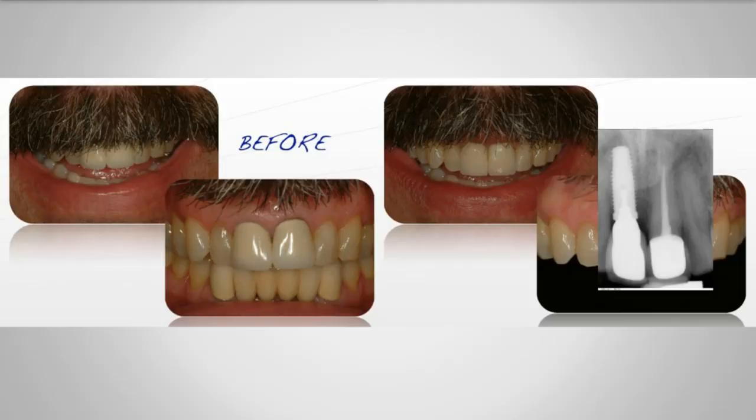Got a couple of questions here. Do I torque down the screw holding the temporary? I don't, and I'll tell you why. You're not going to torque down greater than 20 newtons. You should have significantly more than 20 newtons initial torque. If it makes you feel better, you can hold on to the temporary, but you should not turn it. If it does start to turn, stop and don't go any further.